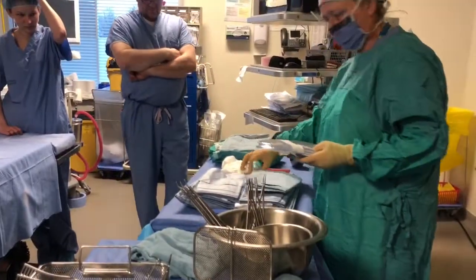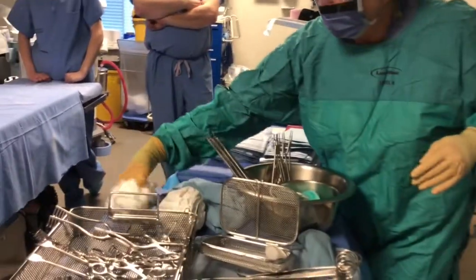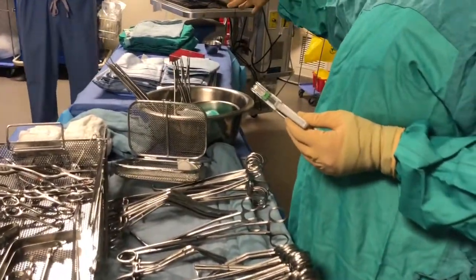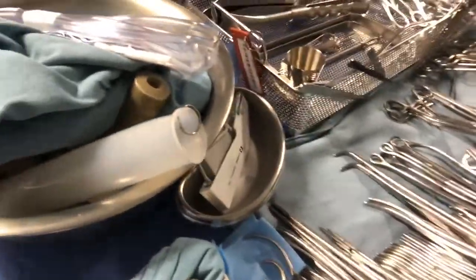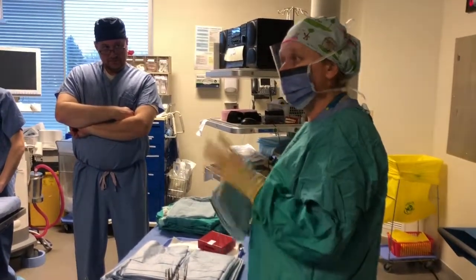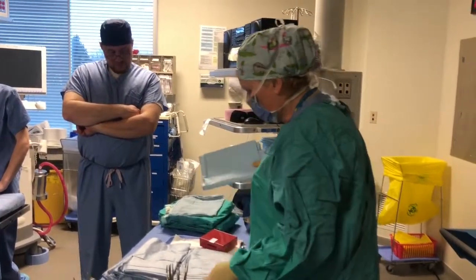Okay. So then I can bring over some of my stuff that eventually I'm going to have loaded. It has to go onto my main table. And you can see I've got my instruments all set up. Now I can start unloading this stuff here. This here would be for an Omni. So we would have another table that we would drape and we would pull out an Omni, and that's the one that I asked you guys to look at. That big retractor. Big retractor, yeah.